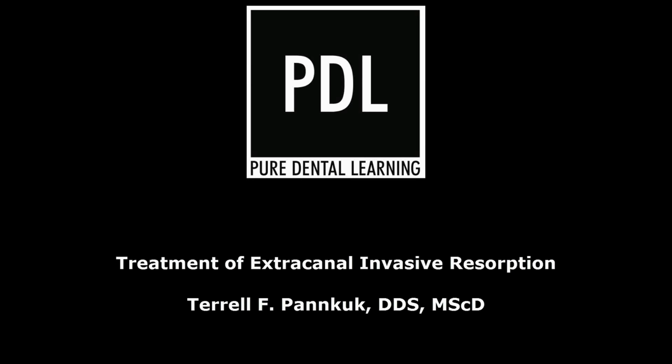Hi, my name is Terry Pannkuk, and I'm going to show a Heithersay Type 3 resorption case on a maxillary first molar.